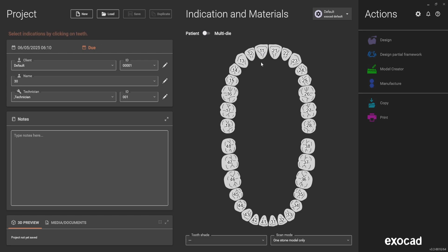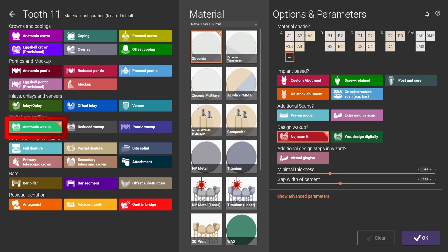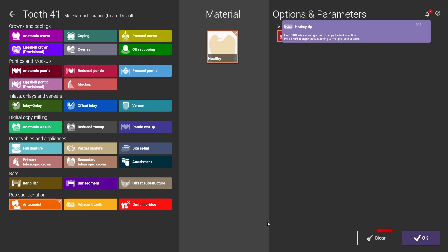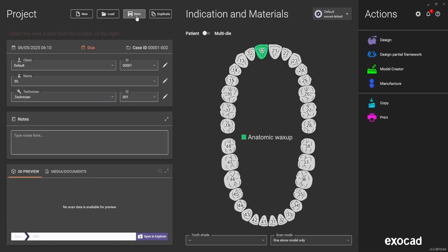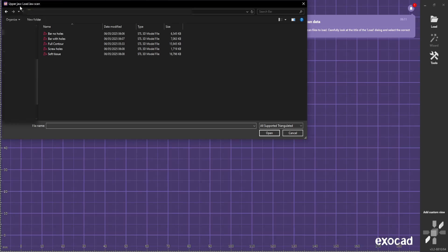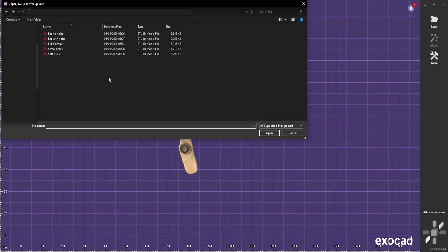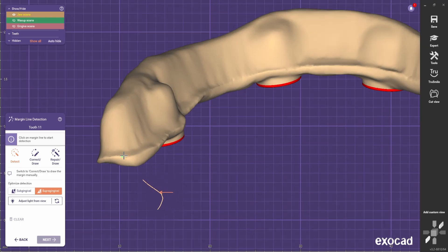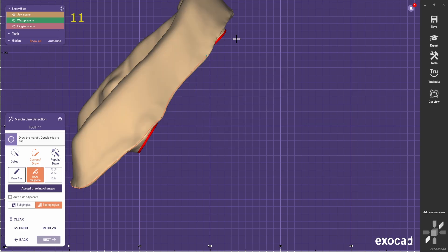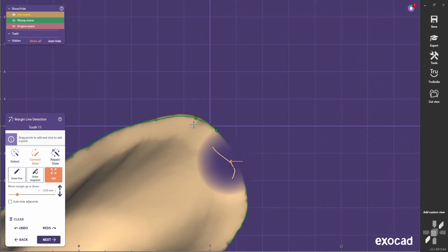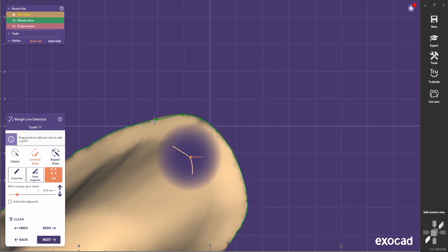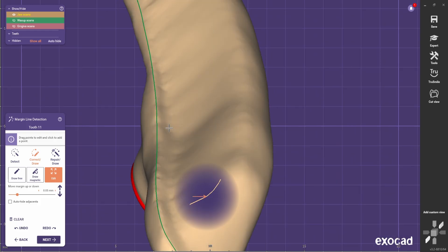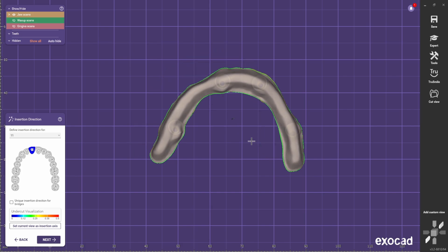After that, we create a new job. Select anatomic wax-up with extra gingiva scan, press OK. We're not going to use the antagonist this time — just to put everything together. Select design. For the upper job, select the bar with no holes; then the full contour is the wax-up; the gingiva is the soft tissue. Select the right orientation and now select the margin of the bar. We need to spend some time correcting the margin — make sure everything is in the right position. After that, go next and set the right insertion path, making sure the margins have no undercuts.